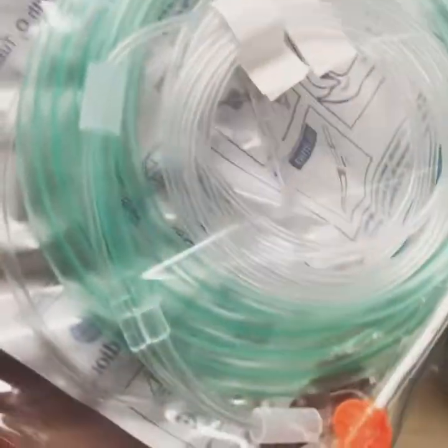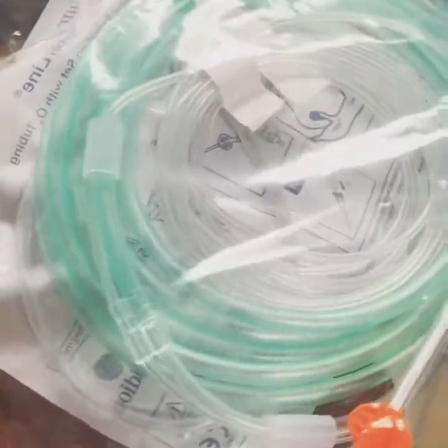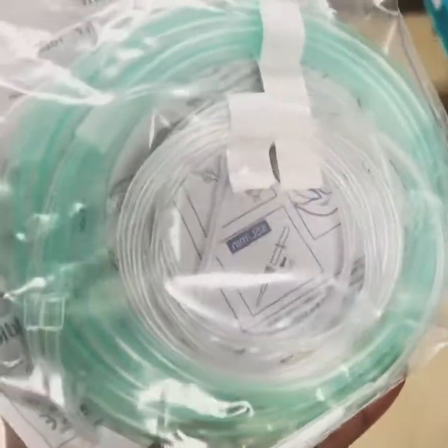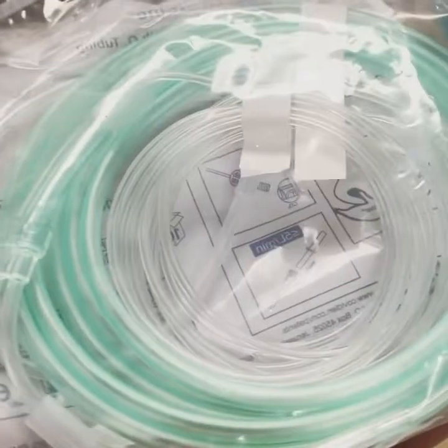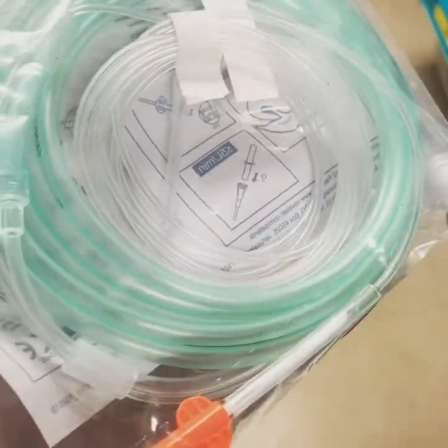Respiratory family. This is our nasal cannula. We go with about five or six liters of oxygen liter flow, which is probably about 45-50% FiO2. Regular sized bore tubing.